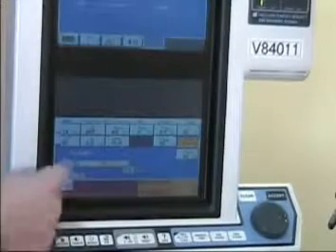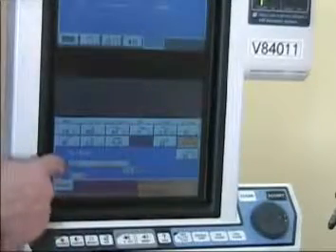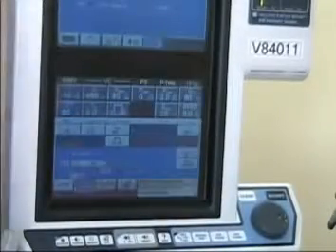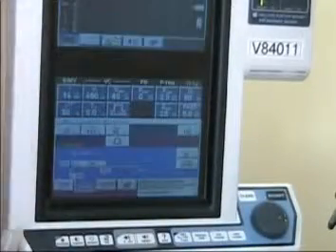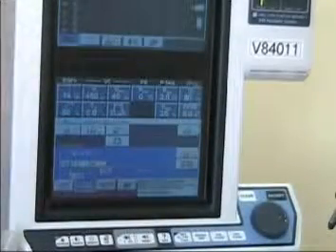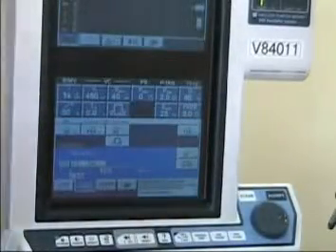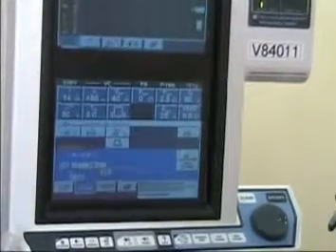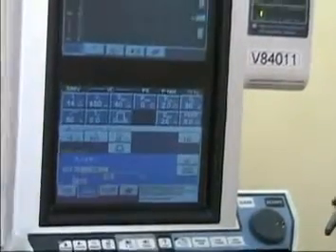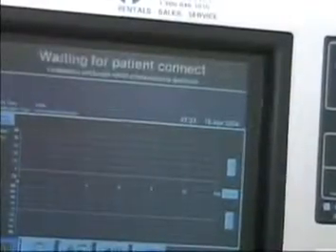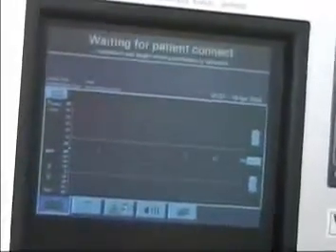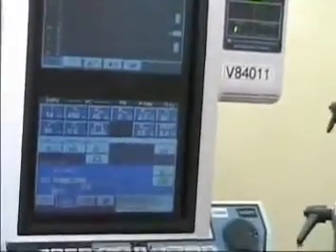Now we have all the settings. We can actually adjust a few other things, but then we press accept. And the ventilator now is in a mode ready for patient use. It is giving us a waiting for patient connection. Note, nothing is happening. The ventilator is not ventilating. It's just in a standby mode.